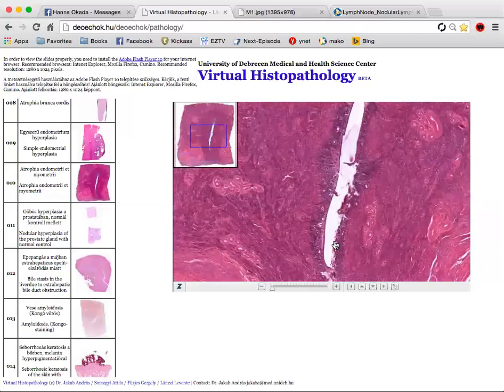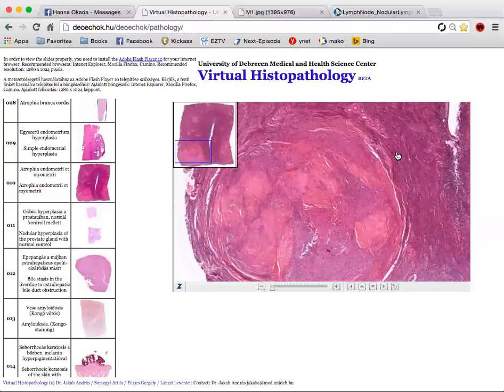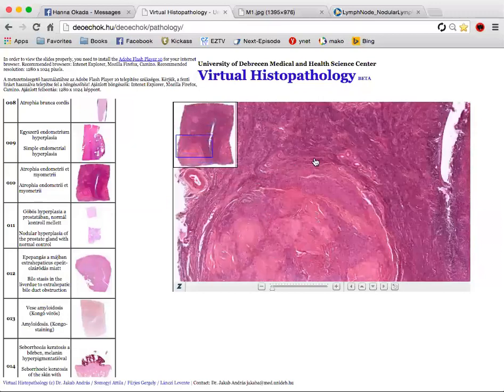So this part of the slide, this is because there's no estrogen. This is the endometrium, so that's because of the lack of estrogen. But in the myometrium, this is hyperplasia of smooth muscle cells. And here you'd see some atrophy of the normal myometrium, because it's pressing on it. Okay, understand. Got it.